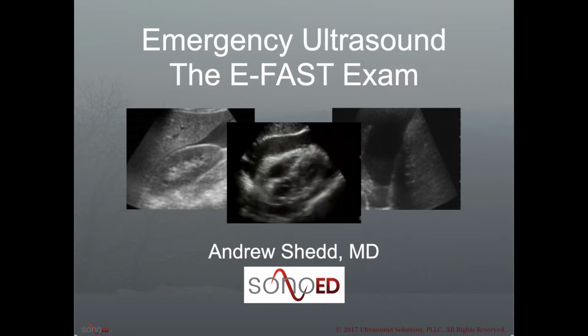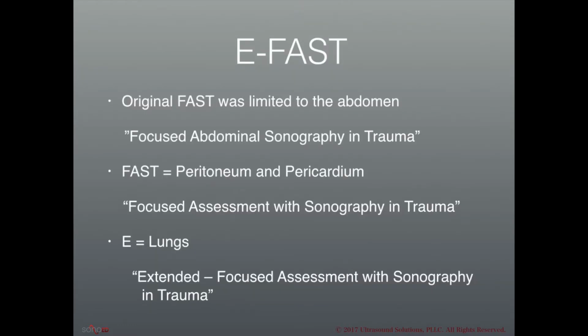But today I want to talk about the EFAST exam, which is probably one of the most common ultrasounds performed at the bedside in the emergency department. The EFAST or FAST exam actually began being used in the 90s to evaluate for free fluid in the abdomen in patients who were critically ill and had had traumatic injuries. Soon thereafter, ultrasound also began to be used to look at the heart to assess for fluid or blood around the heart, and so it changed from focused abdominal sonography in trauma to focused assessment with sonography in trauma, or the FAST exam. And in recent years, some lung views have been added, and so now we often refer to it as the EFAST, or extended focused assessment with sonography in trauma.